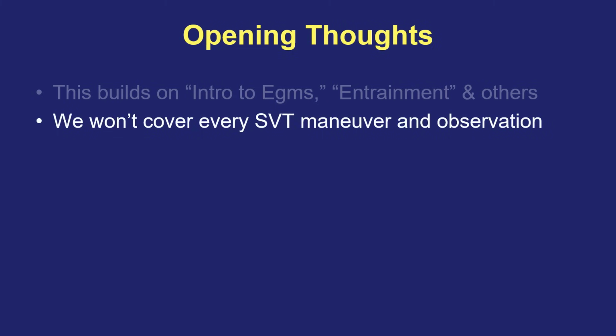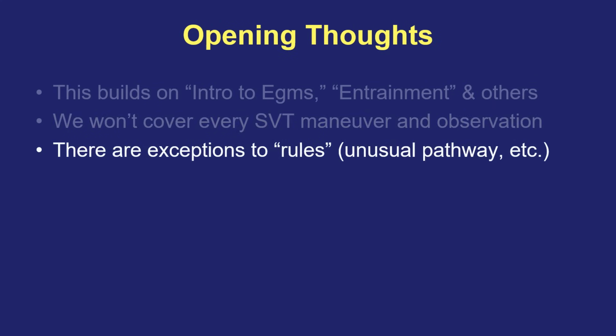I'm not going to cover every single SVT maneuver out there. There are so many, but I'm going to cover the very basic ones and the ones that are the most compelling and strongest that will get you through most of the cases that you will encounter. But recognize that there certainly are other SVT maneuvers, including those that have not even yet been described, that can sometimes be helpful to supplement the ones we will review.